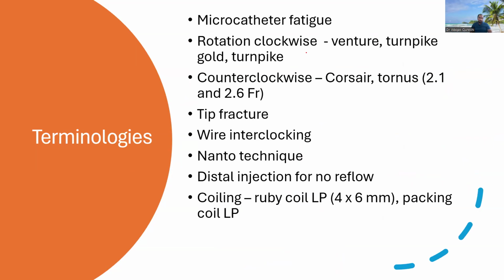This is something you need to look at in this video or memorize. Venture catheter, Turnpike Gold. Turnpikes are clockwise rotation while pushing forwards, and counterclockwise when pulling back. Okay.